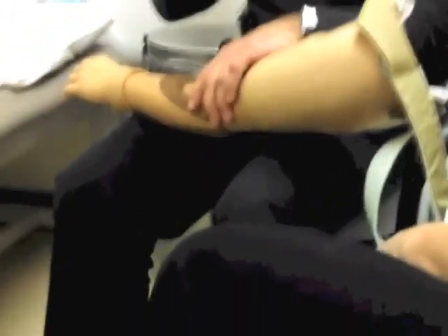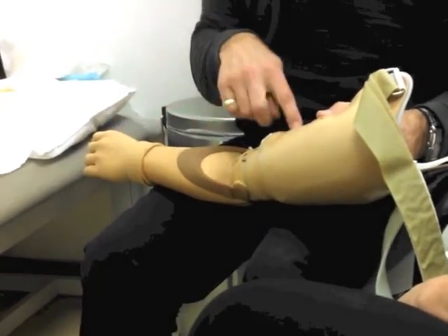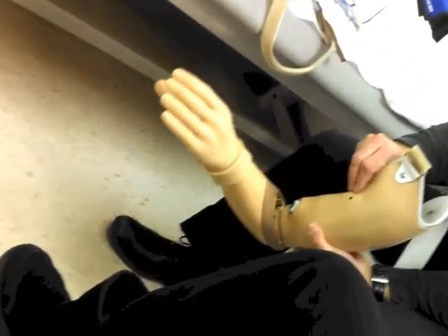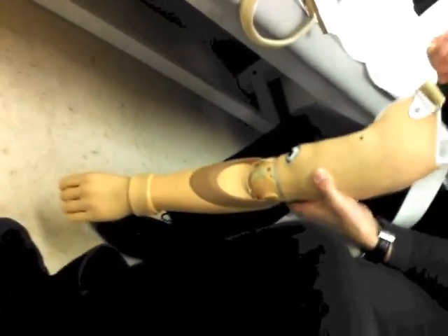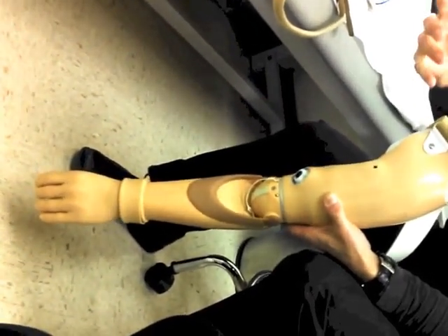As you fire your muscle — your biceps or your triceps, your flexors and extensors — what will happen is you fire the front muscle and it will open and close the hand, rotate the wrist, and raise the elbow, depending on whatever action you're in. Co-contraction is both muscles firing at the same time — front and back muscles together. It's like snapping your fingers. That's how you fire it, that's how we try to teach it.